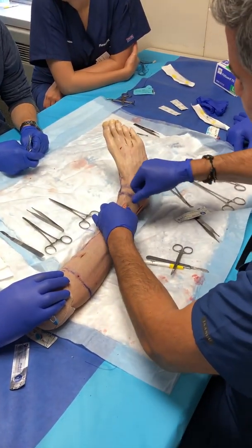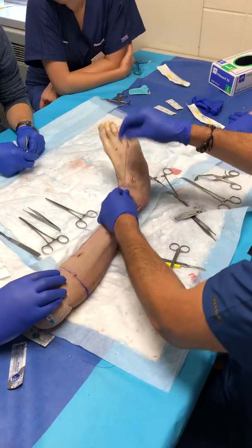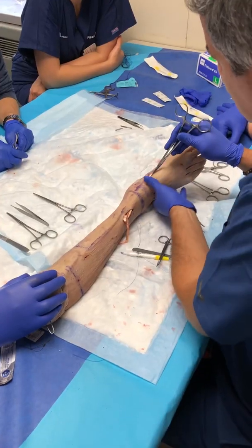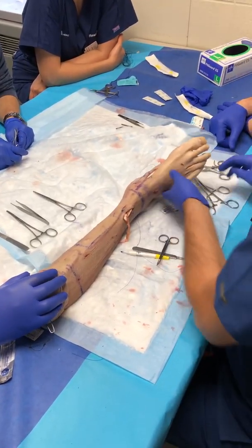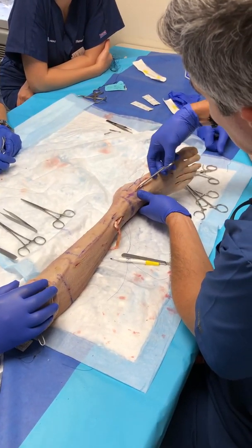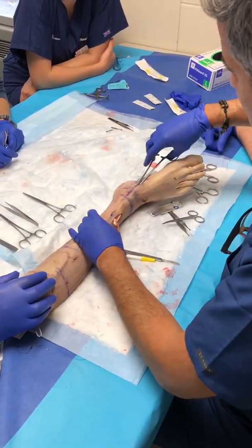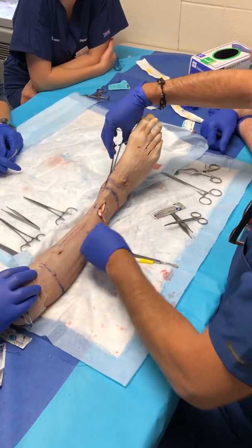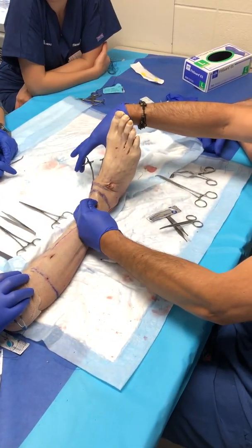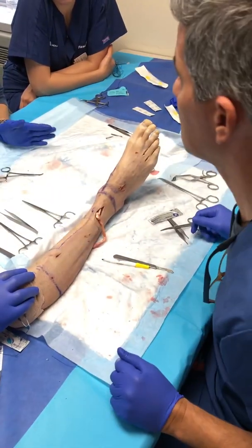Okay, and my recommendation is, let me see if it will cut. And you guys may struggle a little bit. Now, you're gonna go underneath the sheath. You see that right there? Open it up more so you don't struggle. It's not a crime. And you can just kind of free things up a little bit. It will be better, okay? Grab it. You guys see that? Open it. And then when you pull that, it will split it.